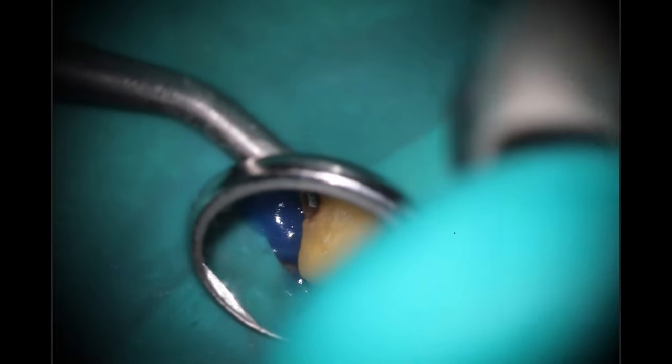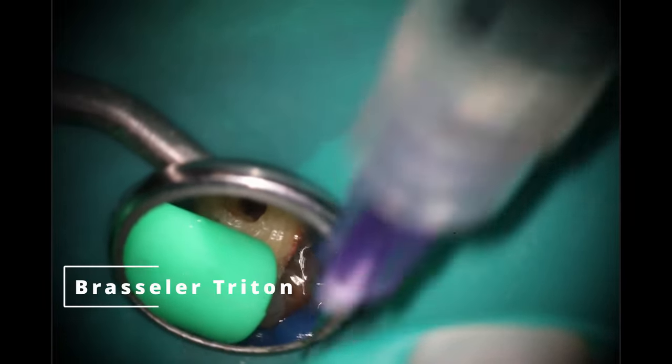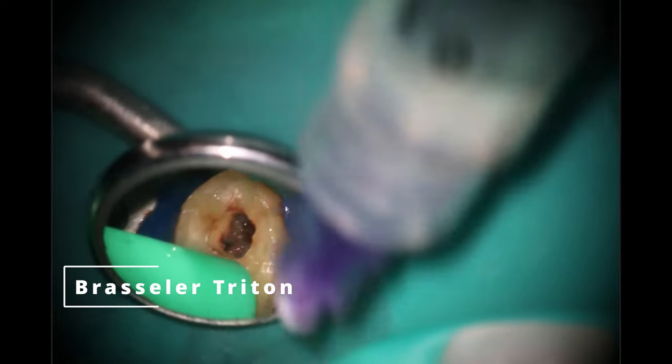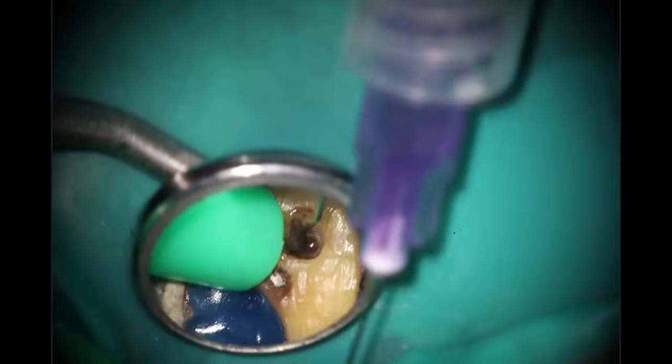So this is working on the palatal. I am trying to find a way to get the mirror so I can see what's going on here and get it into the actual palatal canal. My goal here is to be as conservative as possible — this tooth has already broken down enough, no need to create more trauma there. Nice little puff of blood as we got down there, still using Triton to clean this out. At this point, my distal buccal feels great and the palatal also feels great. MB2 on the other hand is pretty short, so we're going to have to get back inside there.